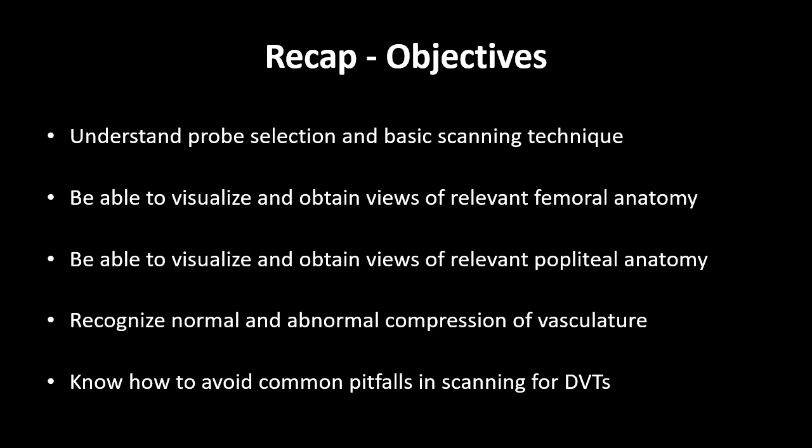We discussed the popliteal anatomy with the tibial plateau anchoring us on the bottom of the screen, and the popliteal vein running superficial to the popliteal artery before trifurcating into the calf veins. Next, we went through how to perform the compression scan, applying vertical pressure every one centimeter and at vascular junctions until the artery starts to deform, with a positive scan having a non-compressible vein, often with echogenic material visualized inside the vessel. In the popliteal region, we provide counter pressure to the patient's knee while we scan proximal to distal from popliteal vein through the trifurcation into the calf vessels.